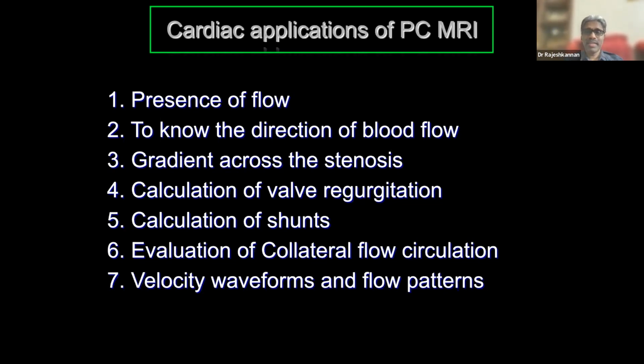So that will be very time consuming. That is needed only in the case of very complex diseases, where you have to take multiple levels. Otherwise, for a single level or one or two levels, you can easily get away with the breath hold sequence itself by taking a true single plane through plane PC.